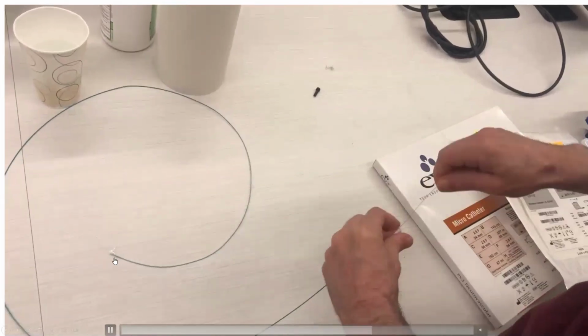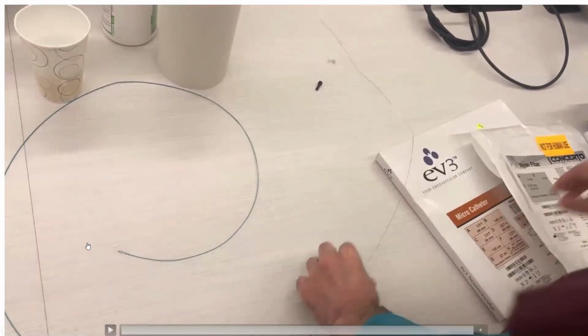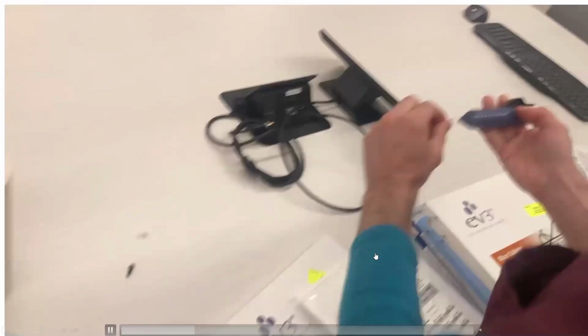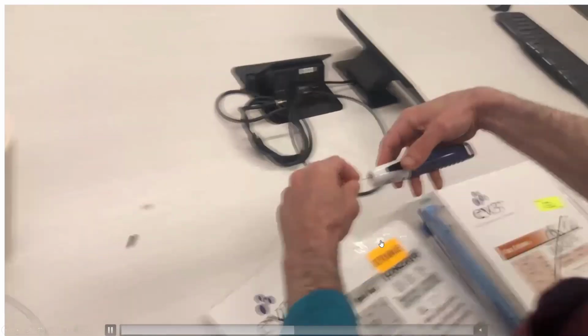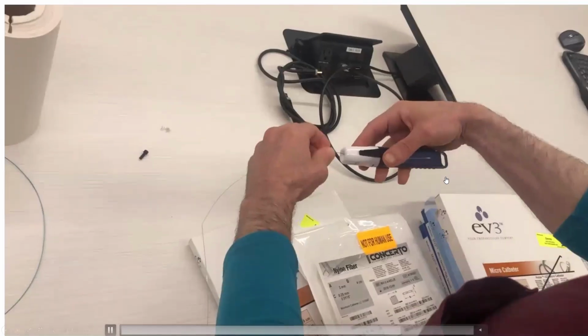Now the wire is attached to those coils. You can move it in and out. You can retrieve them in and out if you don't like the position. Once you like the position in the coronaries, you connect the back end of the coil wire to the wand, and that wand will allow the detachment of the coils.